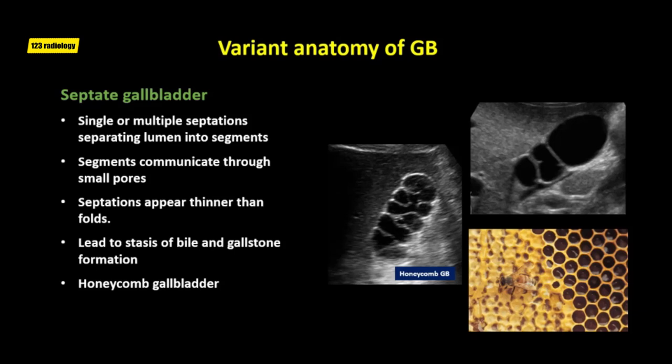Septate gallbladder is a congenital variant where there may be single or multiple septations separating the gallbladder lumen into segments, which communicate through small pores. Septations are rare and generally appear thinner than folds, and lead to stasis of bile and gallstone formation. On ultrasound, multiple communicating septations and locules are seen bridging the gallbladder lumen. The term 'honeycomb gallbladder' describes the sonographic appearance of a multiseptate gallbladder.